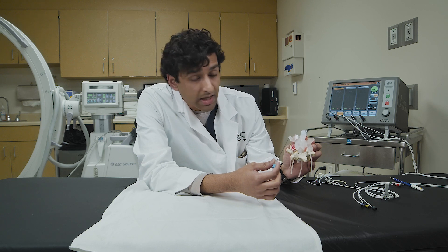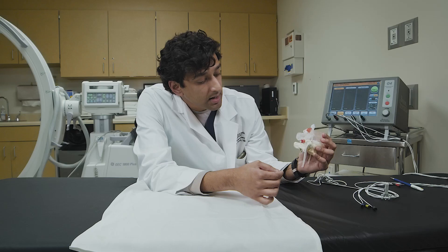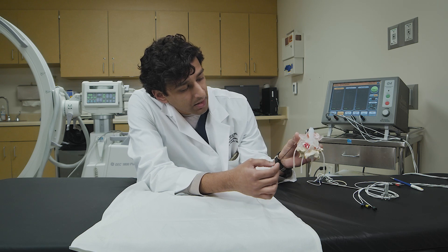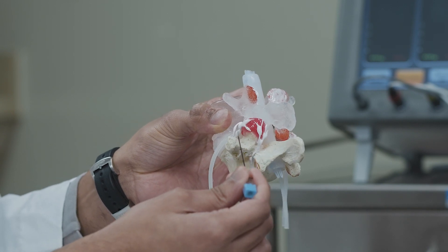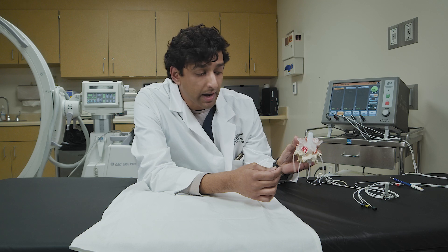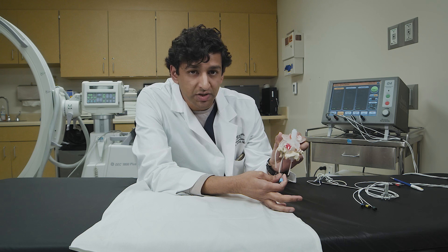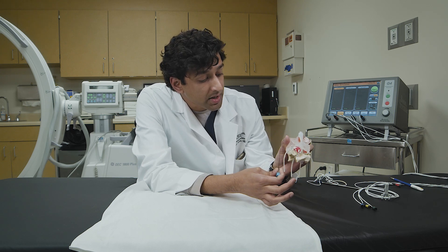Looking at the neural anatomy, we have the spinal cord directly in the middle, and off towards the sides we have nerves going out into your legs — those are our motor branches. On the opposite side, this model depicts smaller branches coming out of the spinal cord and going directly to the inflamed facet joint — these are our sensory branches. For the ablation, we're targeting the sensory branches to decrease the feeling at the area of arthritis and improve pain, while staying away from the motor branches to preserve function of the legs.